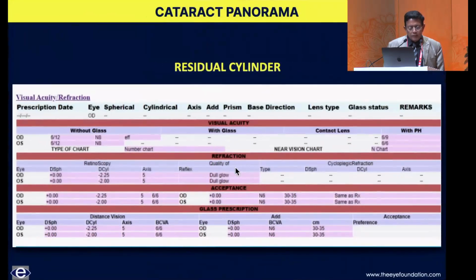about it. And this was the astigmatism, 2.25 in one eye, -2 in the other eye, both operated at the age of around 10 for a developmental cataract. I'd put in a ReSume lens. At that time they were quite okay to wear glasses, but she wanted something to be done about it.